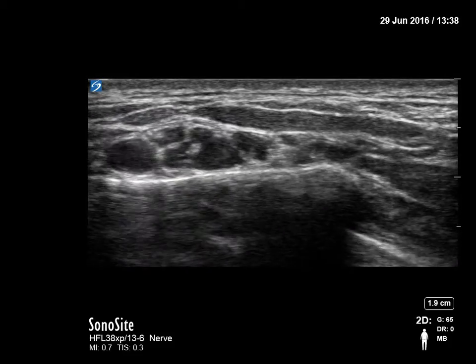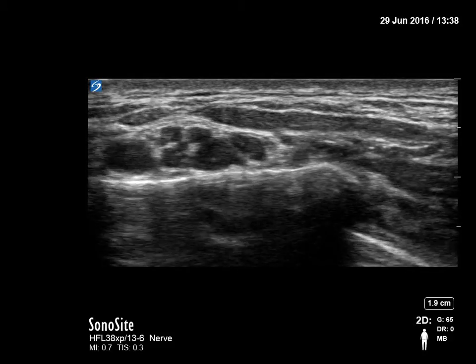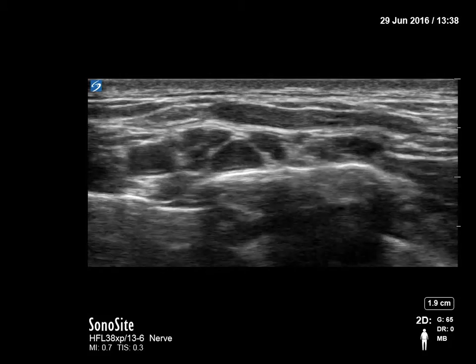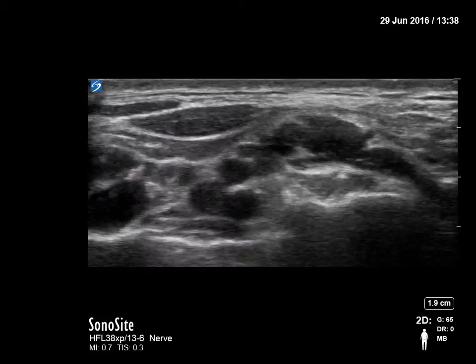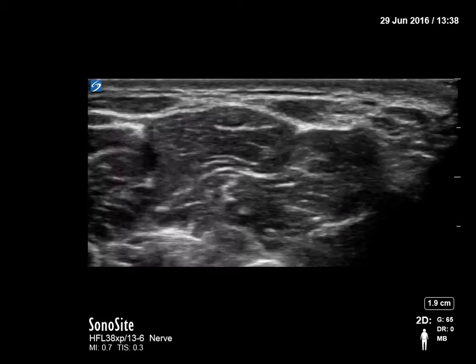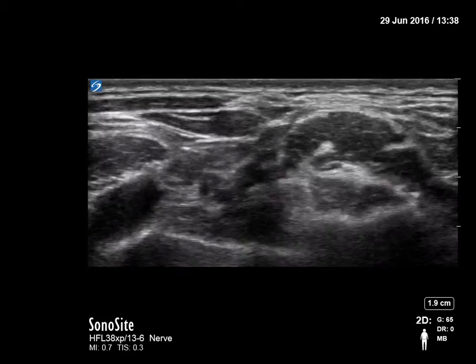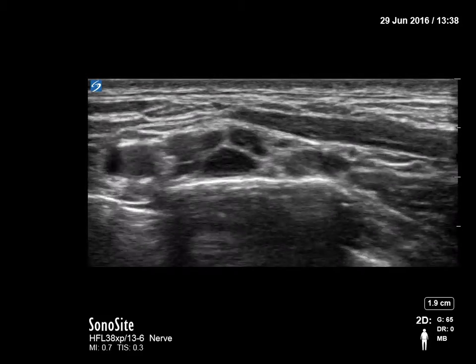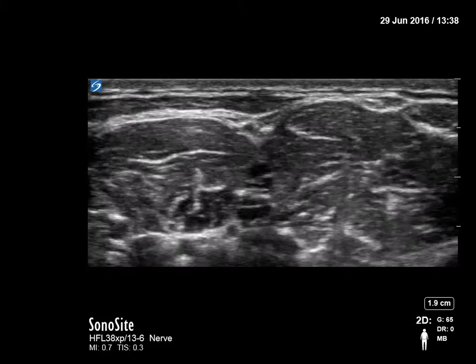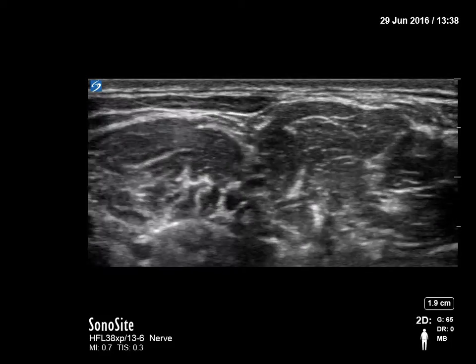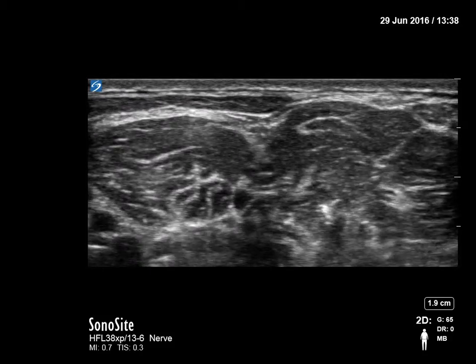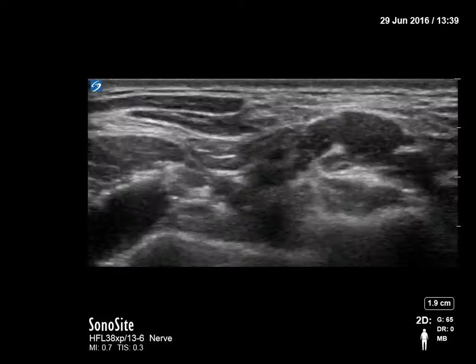A little bit of interscalene anatomy here. Scanning upwards, the pulsating subclavian artery will go away from the picture and two muscles will come into view. In between these two muscles — the anterior scalene and middle scalene — is the interscalene group, which is the same brachial plexus becoming interscalene at that level. You get your shoulder block there.